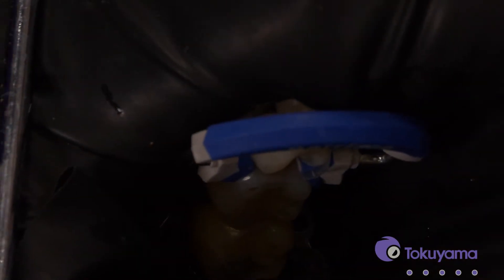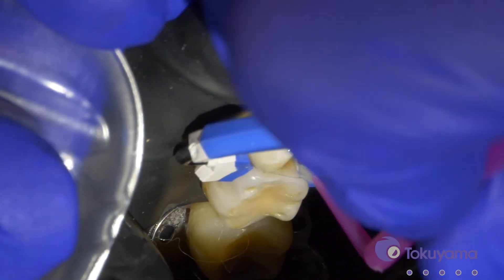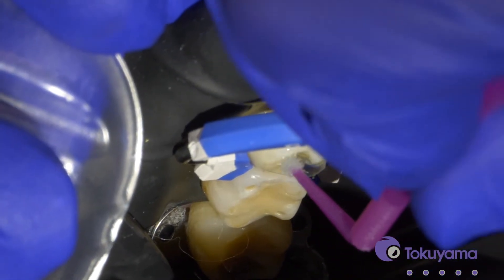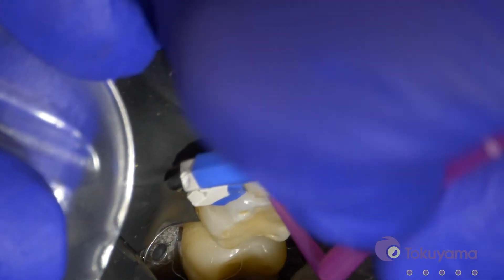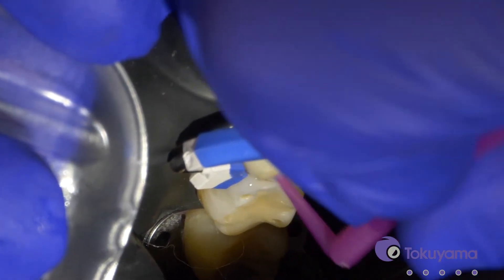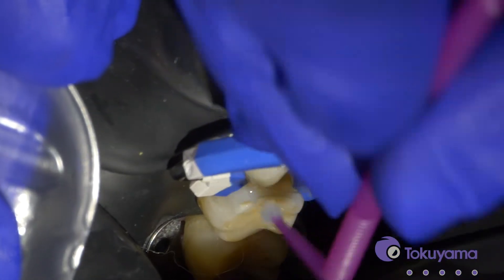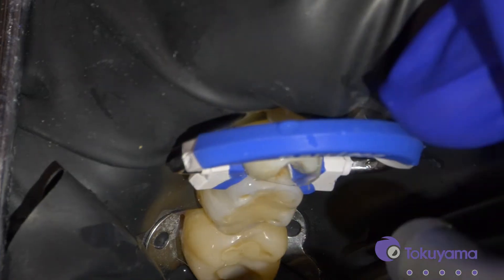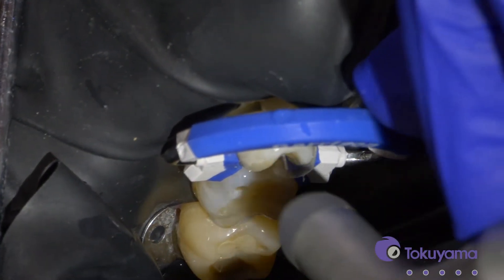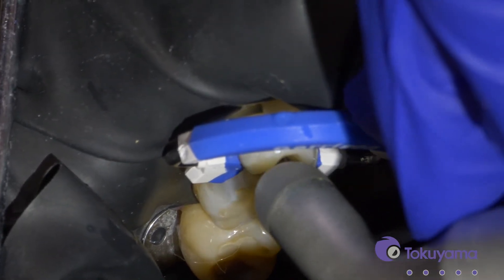We're going to apply the Tokuyama Universal Bond — we just have to get it on the tooth. You don't have to scrub it, just get it into all the surfaces. Then we're going to air dry it: five seconds gentle air and then five seconds a little bit stronger.